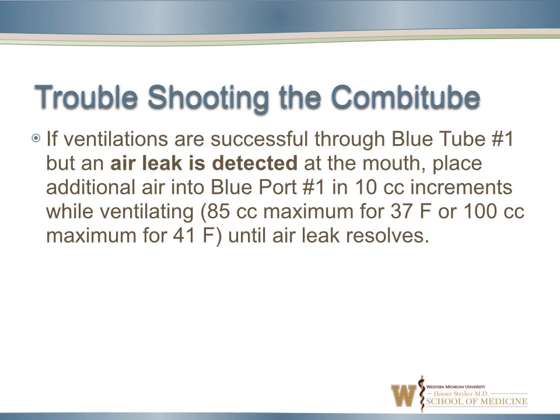If ventilations are successful through blue tube, tube number 1, and an air leak is detected at the mouth, you may place additional air into blue port number 1. You should do this in 10 cc increments while ventilating, up to a maximum of 85 cc's for the Combitube SA, until that air leak resolves. If the air leak does not resolve, you should deflate both cuffs completely, remove the Combitube, go back to BVM and an oral airway until you can secure another advanced airway.